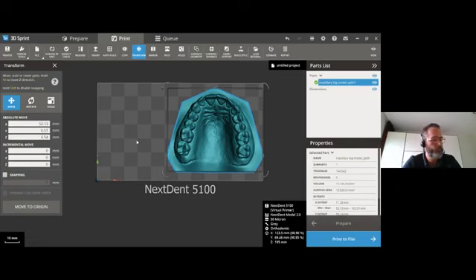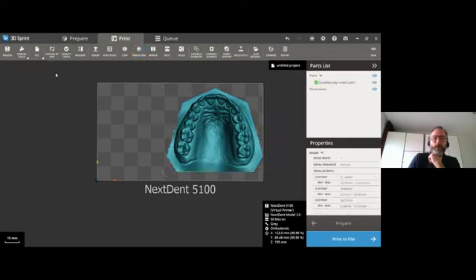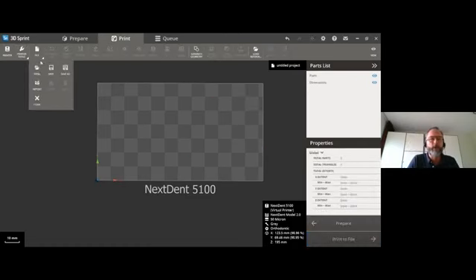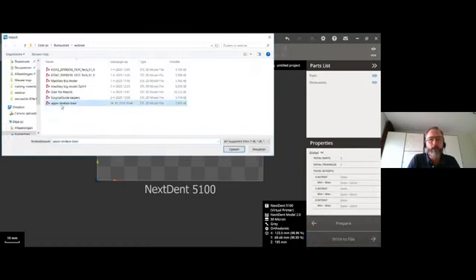We take it back to dentures now. You showed the orientation of the denture base. Is that the recommended denture base orientation, and why is it? Yeah, again, a good question. The denture base for the CE is not yet available. So that's why currently the application team is looking at what would be the best orientation for printing dentures. And let me see if I can take the denture. It's always easier to explain when you have the real thing at hand.